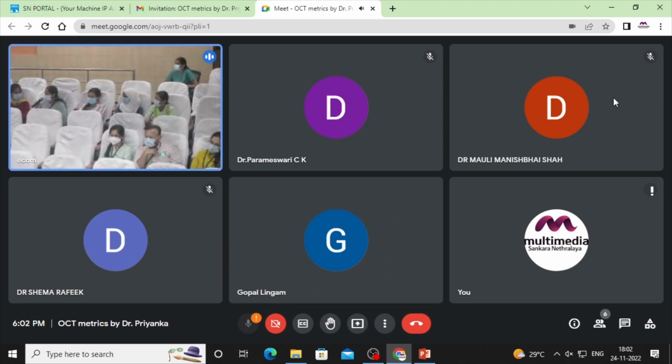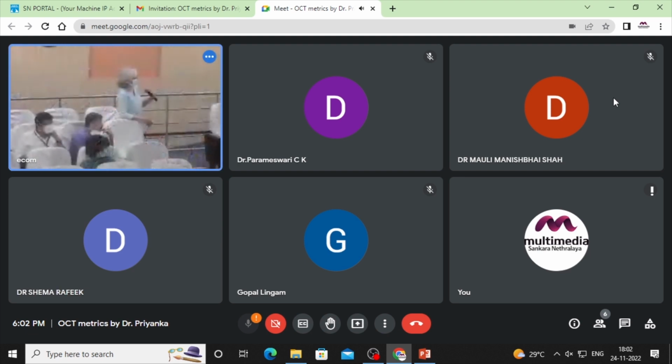Akshat, Ritika, Manpreet, all experienced with using only Heidelberg for 1 year. Any suggestions? Did you notice anything? Because we are spoiled for choice. We can say, it doesn't fix, we'll do this; it doesn't fix, we'll do that. What about the Heidelberg OCTA? They have that there. No? Okay. Manpreet? No. Purna has had a long innings.